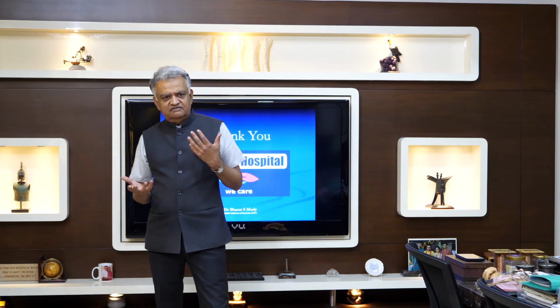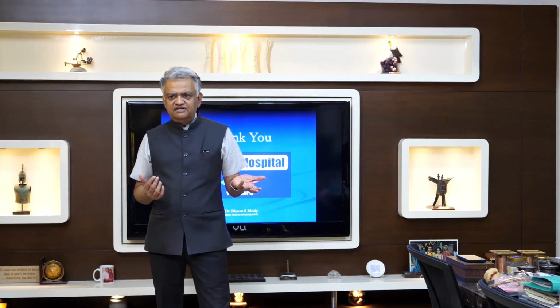Of these, the vast majority, the chances are that for the next 10 years of your careers, you are only going to use the fixed bearing, either cruciate sacrificing or cruciate retaining. Depends upon which religion you eventually gravitate towards. In either case, going into the finer aspects of implant selection, once you have decided that, okay, I'm going to use a cruciate sacrificing as the workhorse of my practice, then you need to understand that when you select your implant, there are so many finer aspects like the quality of the plastic, the grade of the plastic, the locking mechanism, and the J curve. We'll talk about that again. What is the meaning of a single radius femoral component design as compared to a multi-radius, which is a J curve? So these are again going into the details of it.